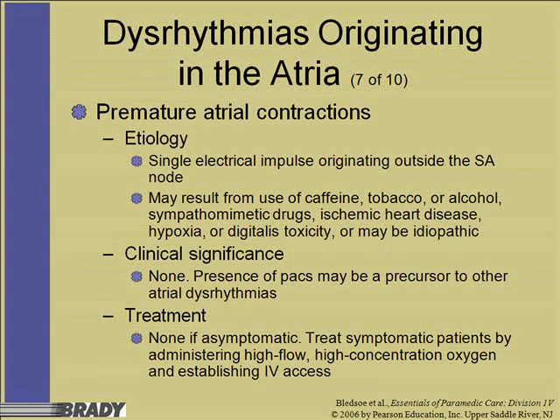Typically, there's no clinical significance. Presence of PACs may be a precursor, again, to other atrial dysrhythmias, but in general, PACs from time to time are no big deal. They just may or may not happen. If you've got an asymptomatic patient that's not describing any pain or discomfort, then that may just be what they have on a regular basis.